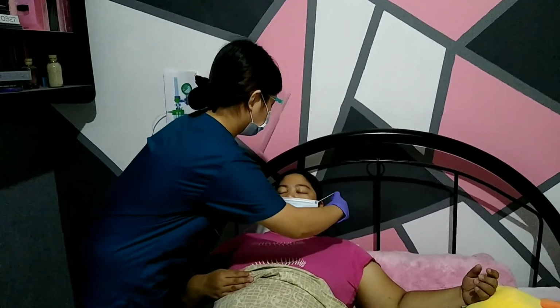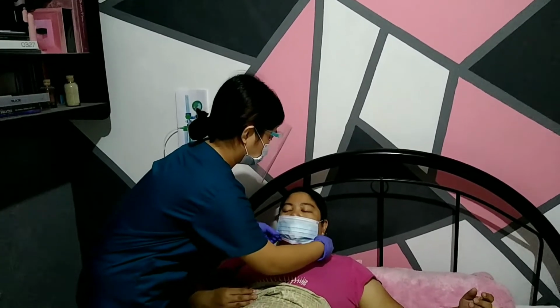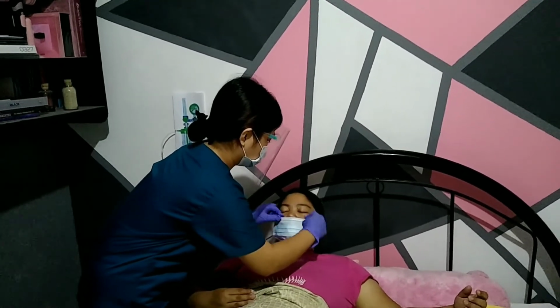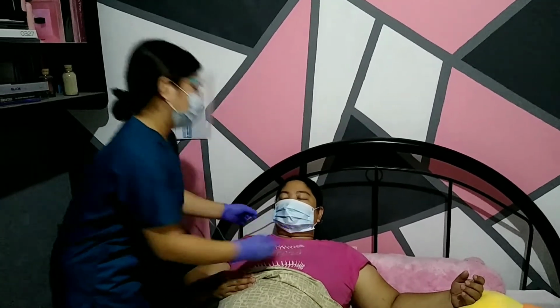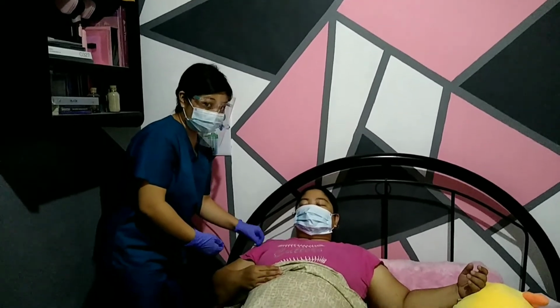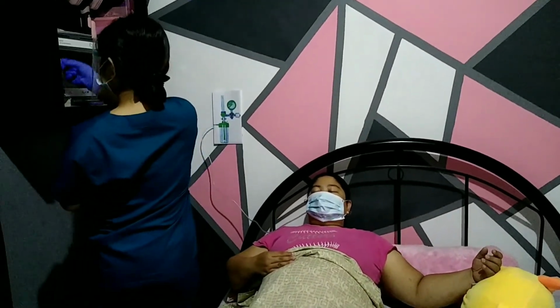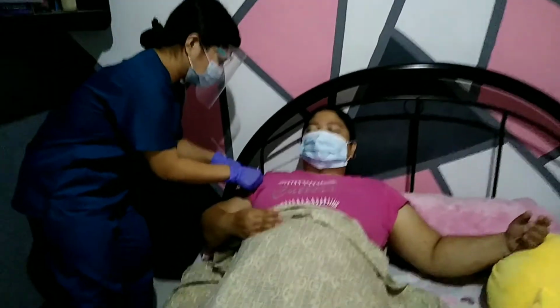And then don't forget to bring the straps overhead. And then that's it. And then maintain sufficient slack on oxygen tubing secured to the patient's clothes. We are going to use the micropore here to secure.